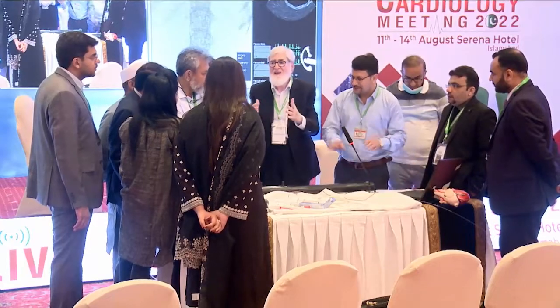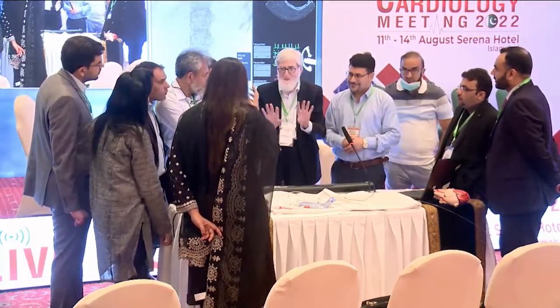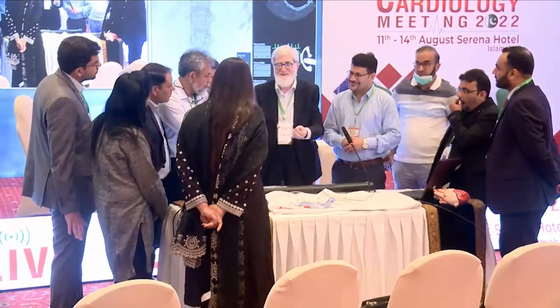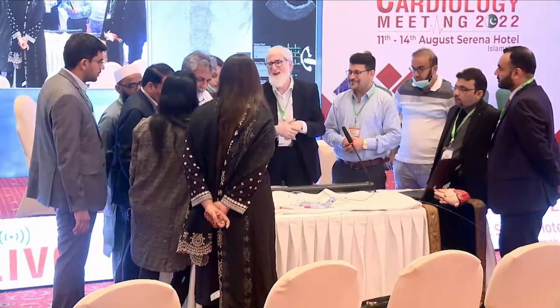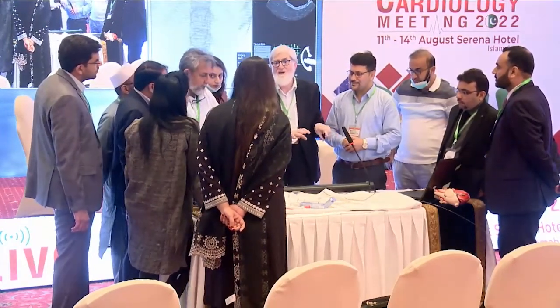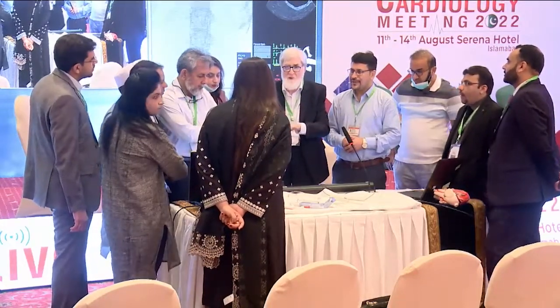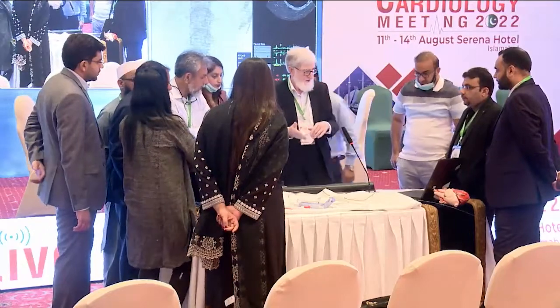Like yesterday night, we were missing one step. That was flushing. Flushing is virtual here, so if we were not flushing, the thing was not going. So this makes you go according to the system. Just start the thing.